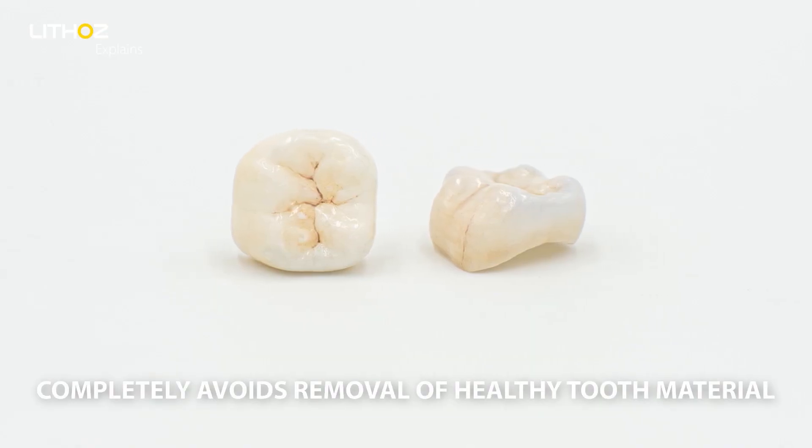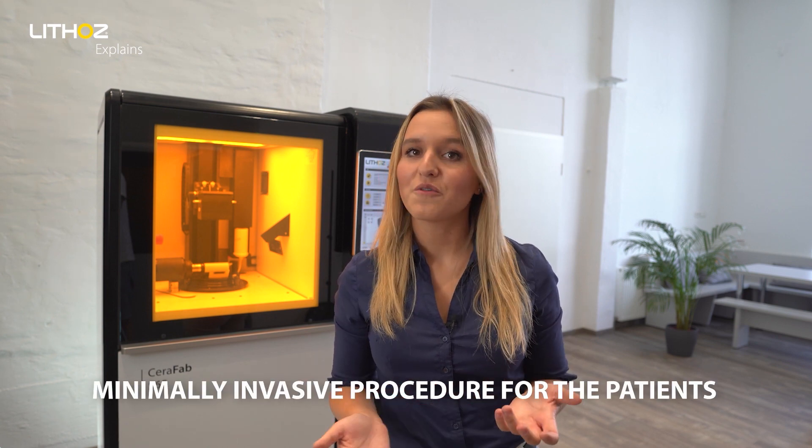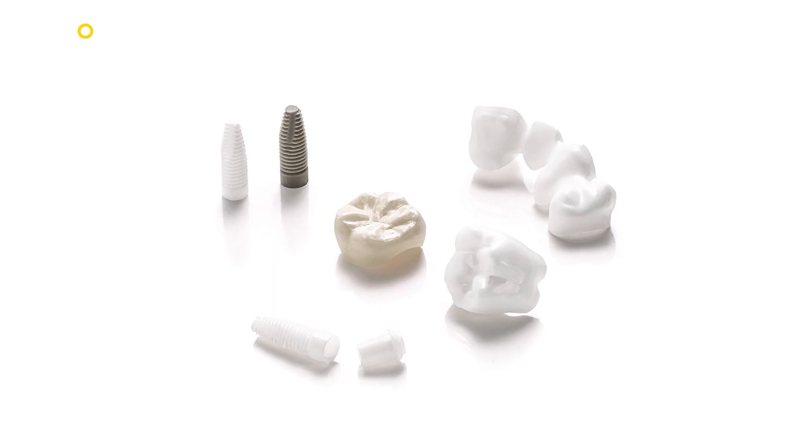After some post-processing, the restoration is ready to be fitted, completely avoiding any removal of healthy tooth material and therefore ensuring a minimal invasive procedure for our patients. These 3D printed ceramic parts are just as strong as those produced using traditional methods, but are far easier, quicker, and more cost effective for both you and your patients.